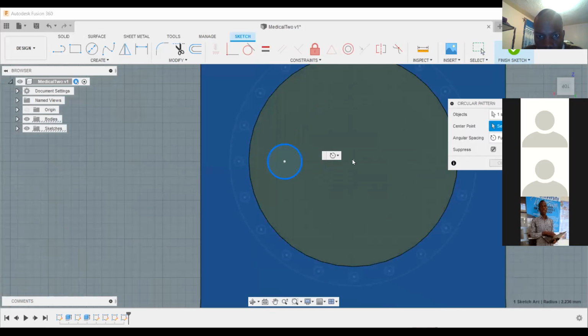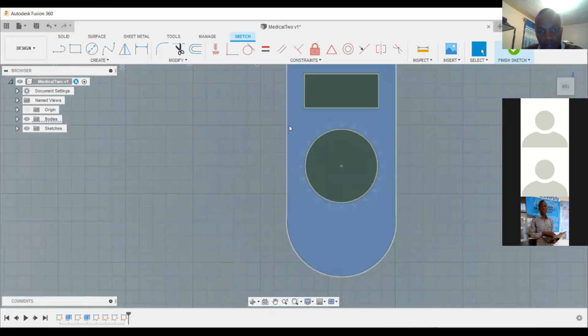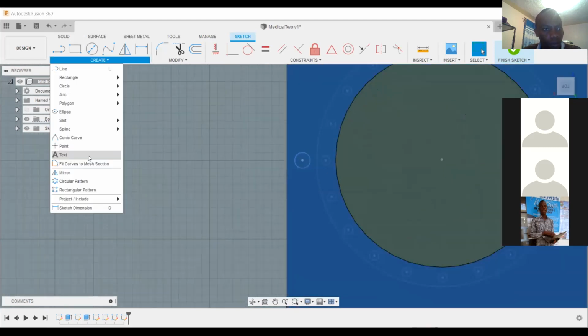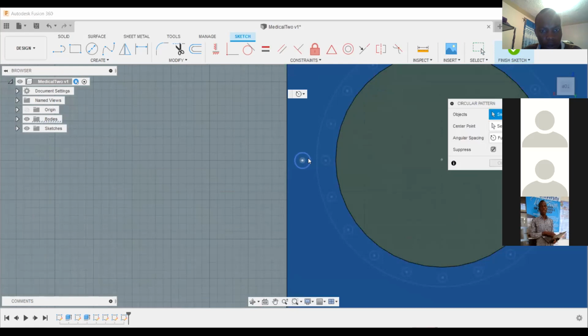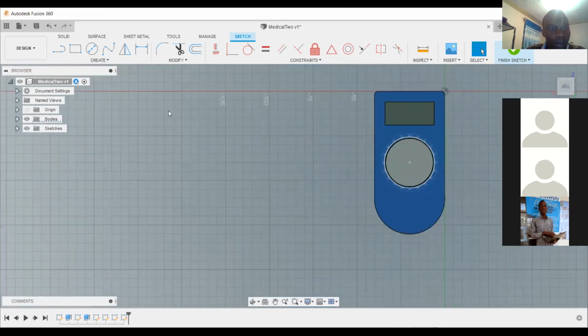So you should create full. I'd done it before, I don't know why now. There's something which is locking the drawing. I don't know what this could be all about. But I'm going to show you with another one. Let me just show you another one.